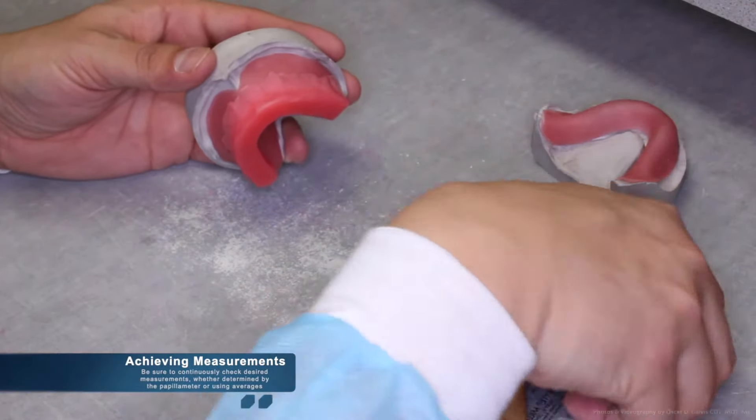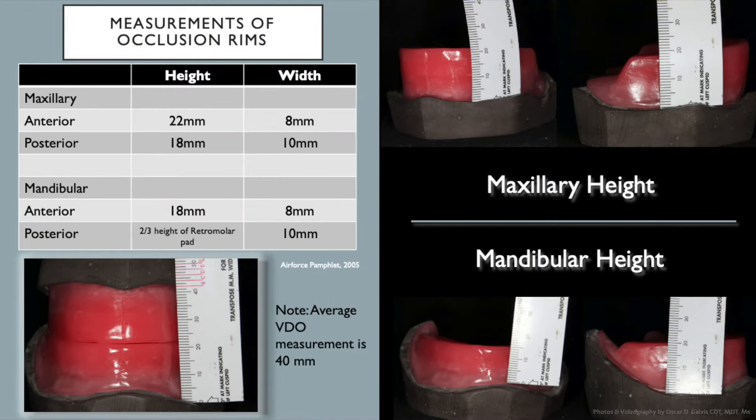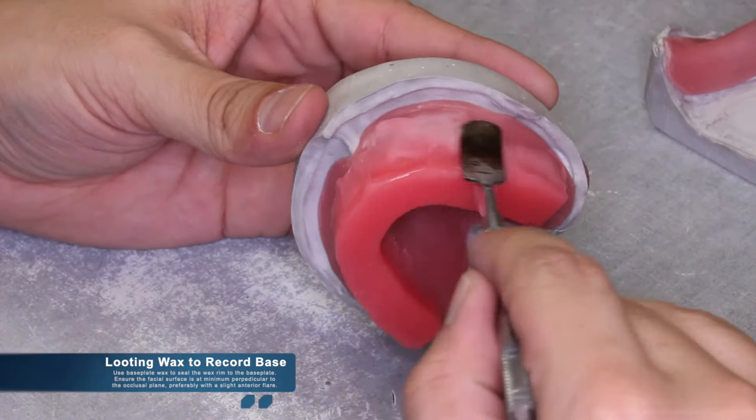During occlusion rim fabrication, continuously check for desired measurements, whether using a papillometer or average measurements. The average measurements for a maxillary occlusion rim are: 22 millimeters of height in the anterior and 18 millimeters in the posterior; width should be 8 millimeters in the anterior and 10 millimeters in the posterior. Once desired measurements are reached, lute the wax to the record base using base plate wax. Ensure the facial surface is at a minimum perpendicular to the occlusal plane, and preferably with a slight anterior tilt.